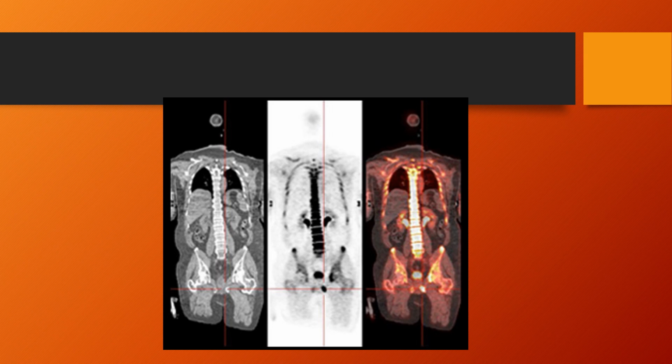The cool thing about that, when you fuse it with CT, you see all the internal organs from the CT, but only the bones are actually lighting up because that's where the radioactivity is. So with all the advantages of sodium fluoride being more sensitive, more specific, just better image quality, and a couple of case studies that I showed you, it really does improve the outcome and the treatment plan for patients because you find metastatic disease that you would have missed on a regular bone scan.